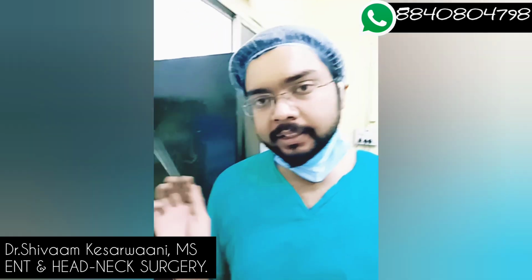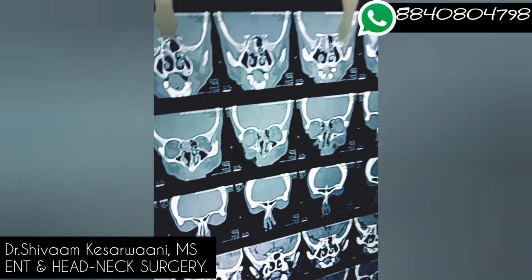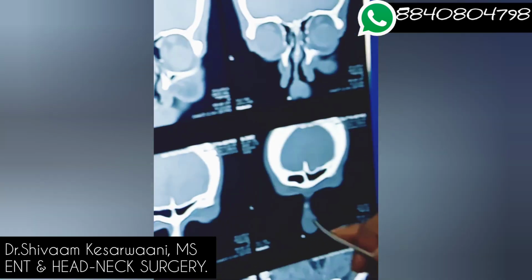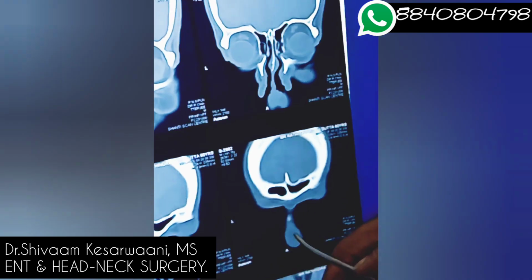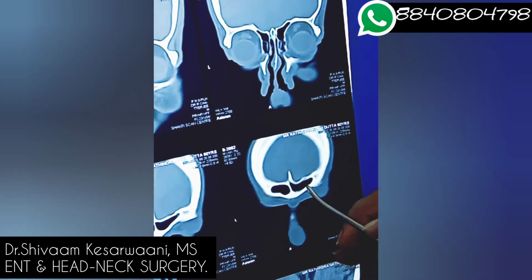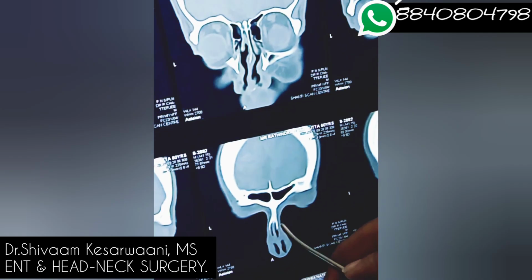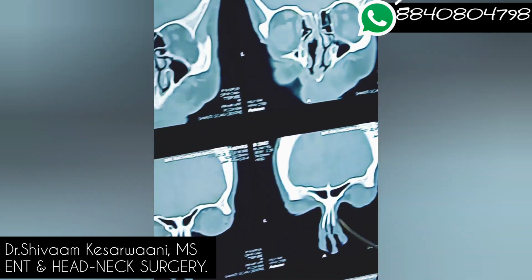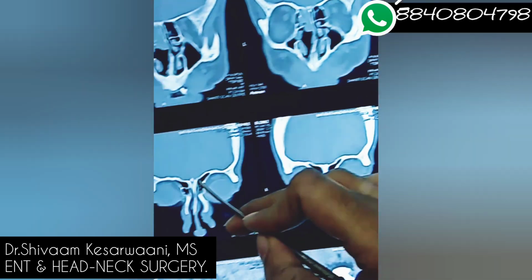So, if we see the CT scan, that is the nose and paranasal non-contrast CT scan of this patient, and see the involvement that is there. Starting from the anterior most cut of the coronal, we can see here that our frontal sinuses are not involved, right? So grossly we will see the CT scan. This is the nasal bone that is appearing, right? Bony nasal septum, both side nasal bones. The frontal sinuses are clear here also.